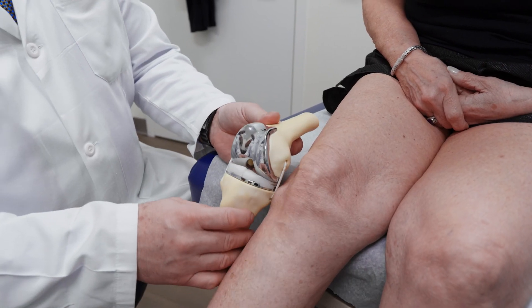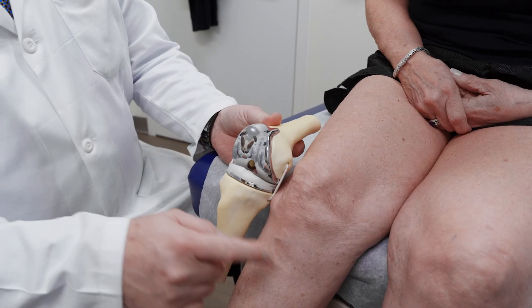A 3D printed knee replacement is a knee replacement that copies the unique anatomy of that patient's knee. This is done from a CT scan that makes the 3D model, and off of that 3D model, the implant is designed to re-duplicate the exact anatomy.